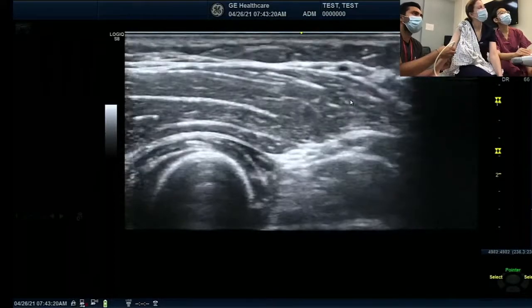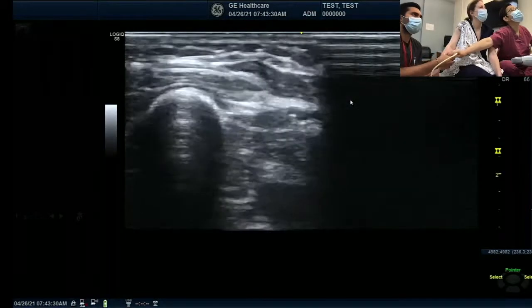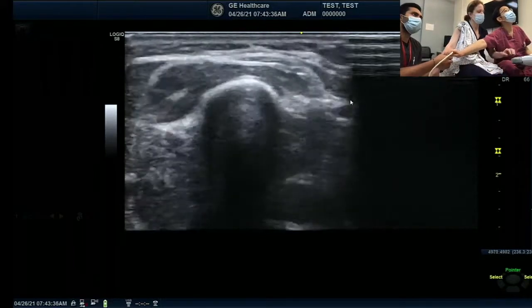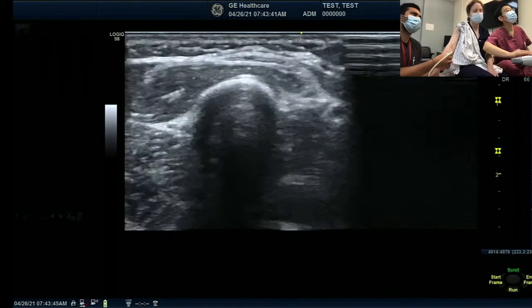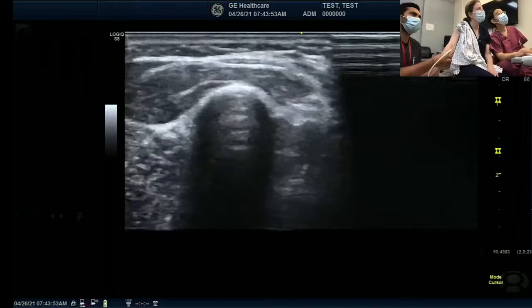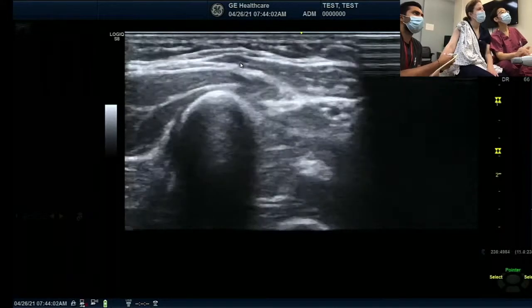That's weird. And then can you maybe wiggle continuously brachioradially? Maybe it's on top already. I think this is about on the top. Here, can you stay here? It feels like it's this thing, because when I pressed I was thinking this is the one. Look at that. Okay, move going up. Yeah, could be too. Good. See? Oh, something's moving. Here. This one. This area.